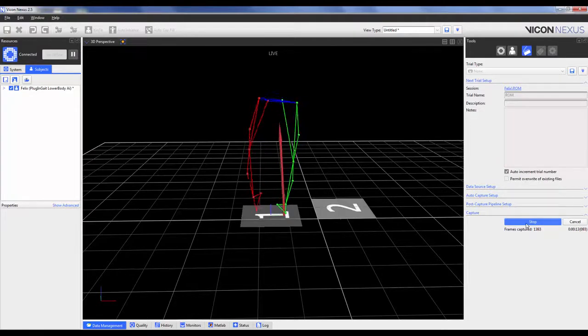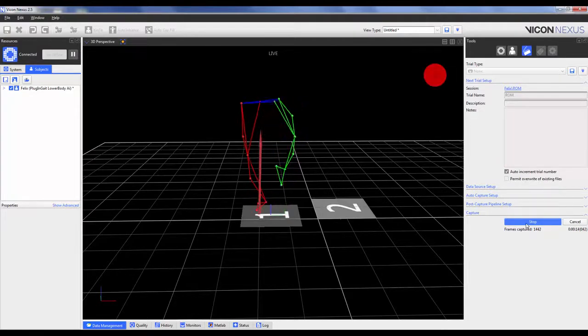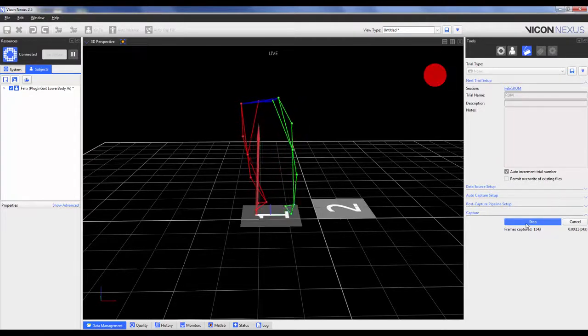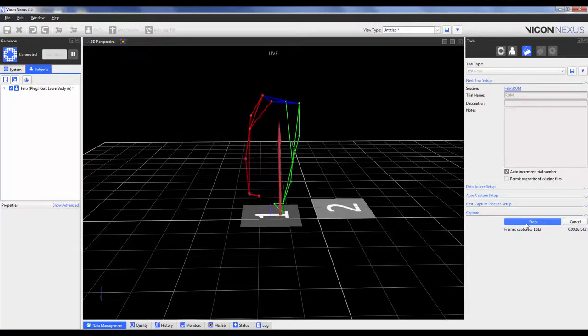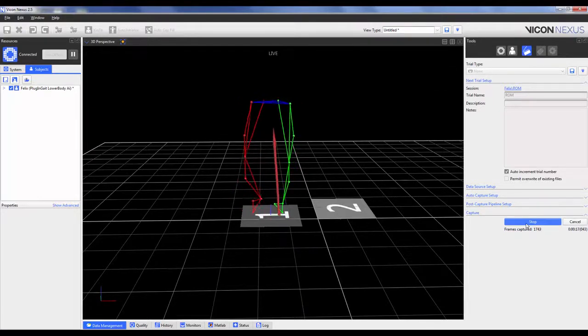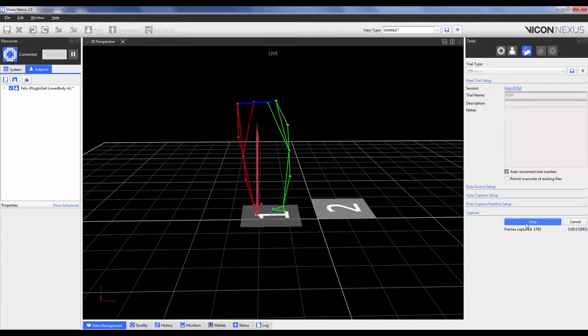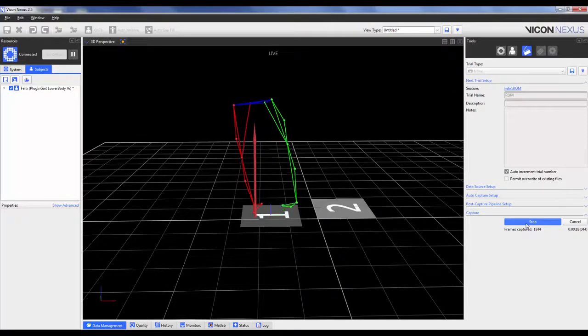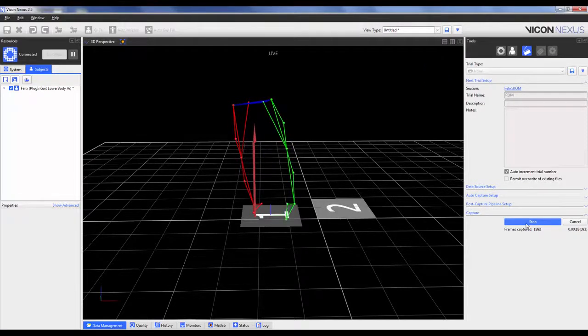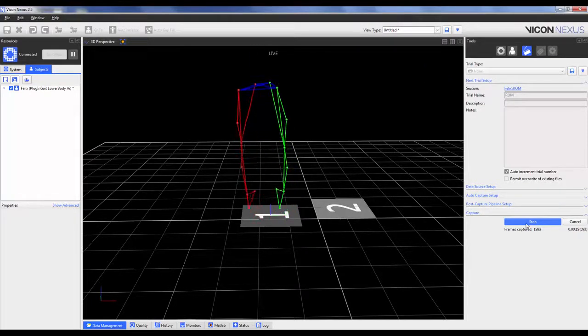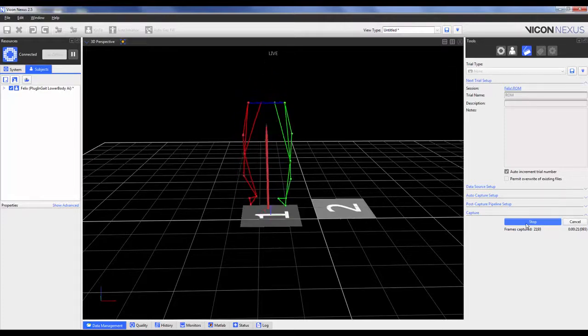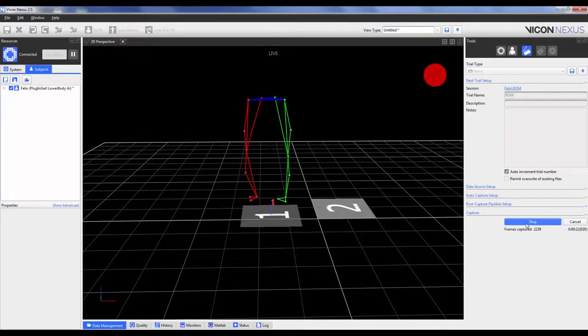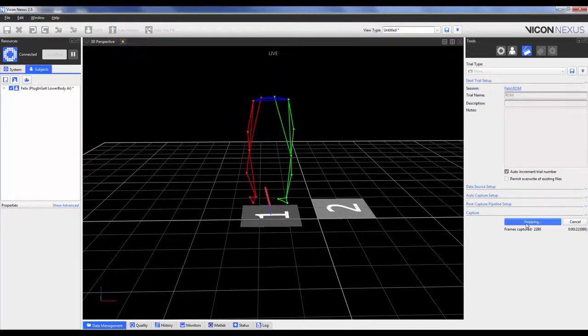This time, I will capture the trial in the Data Capture tab and add a note so that I know that it is my ROM trial. So we'll have the subject start in the motorbike, they will perform a star arc, they will then perform a knee flexion extension across the entire range, then some ankle circles, and then we'll go ahead and do a few hops.